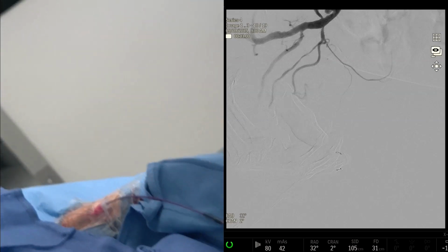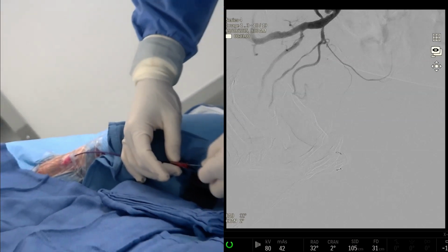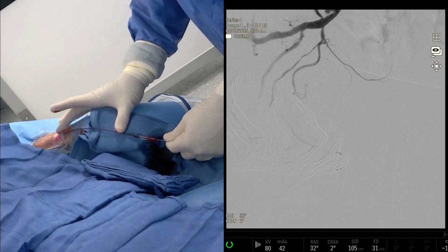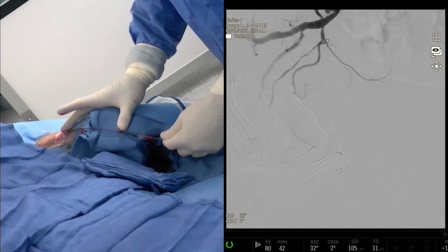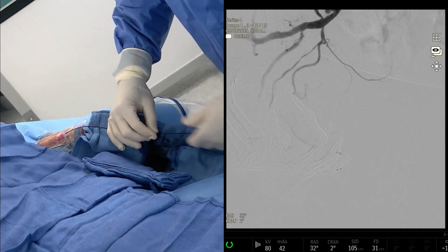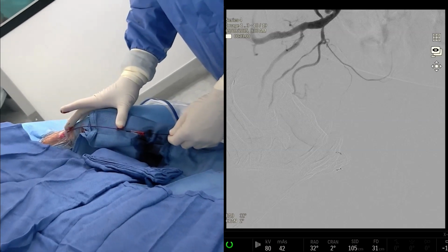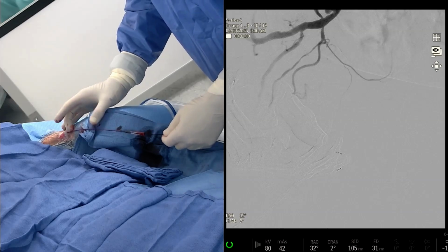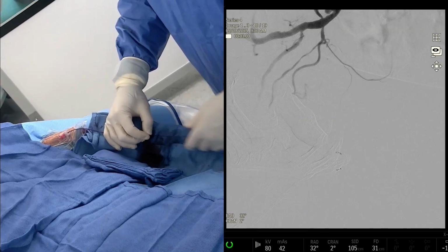The other thing about this catheter is it's 130 centimeters, and so you can see how much we have to work with here. So if we needed to actually put this catheter a little bit further into the vessel, which we sometimes have to do, we're going to have a fair amount of room there. So sometimes we'll use a 125 centimeter catheter, but that's going to be almost hubbed in some patients, and so we like the length of this quite a bit.